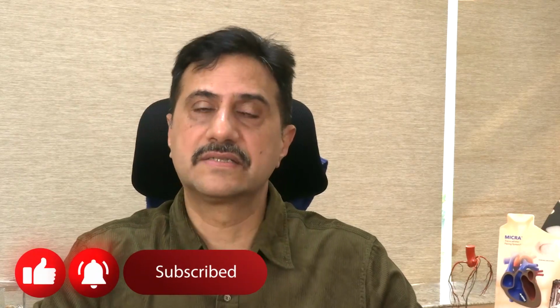The procedure lasts for about 1.5 to 2 hours, is carried out under local anesthesia, and the patient is speaking to us during this procedure. After the procedure, the patient is taken into ICU for about 24 hours of observation and can walk the very same day. This is the animation which shows you how this procedure is carried out.